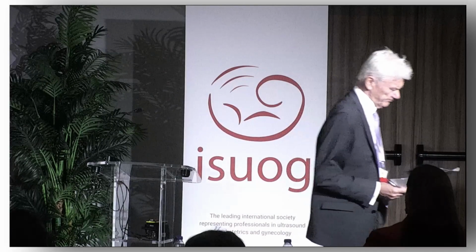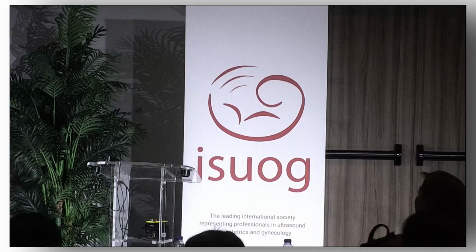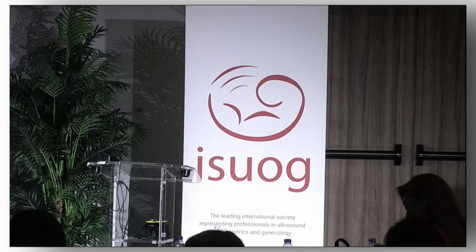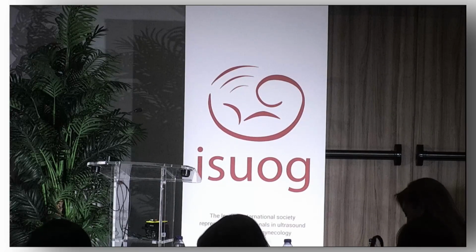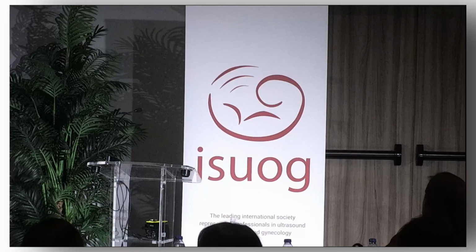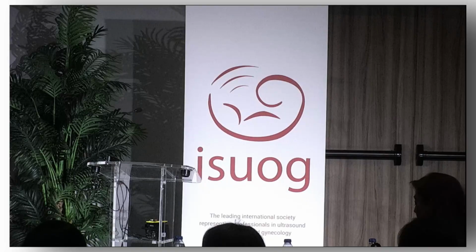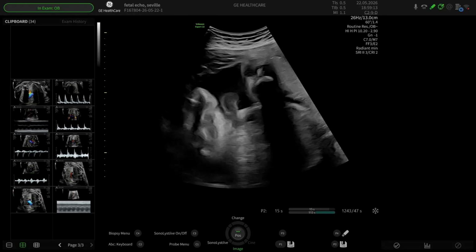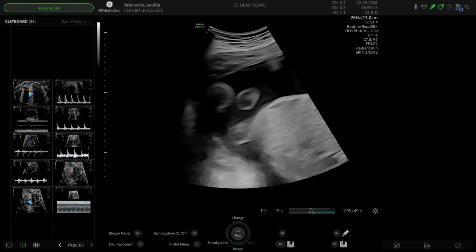Perfect. So we are here with this baby that is 28 weeks, Nicolas. And let's imagine that this baby has been referred because they suspect that maybe there is a rhythm anomaly, that maybe there is one of these arrhythmias that Julien very nicely has been showing. So the first thing that I would do to check the rhythm is to start from the easy and then go to the difficult ones.